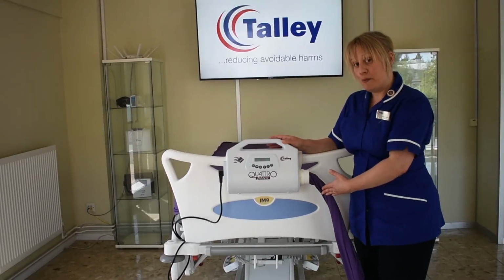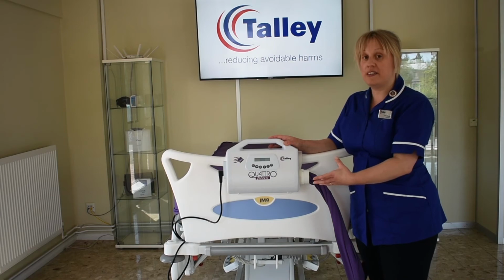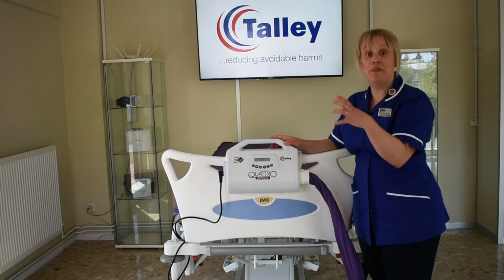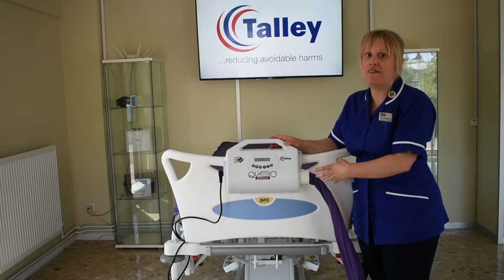Let's have a look at transport mode. So transport mode can be used as and when your patient is being transported somewhere on the mattress. And once it's in transport mode, the mattress will basically keep the air inside the mattress without it then deflating onto the patient, and that will be good for approximately 12 hours.